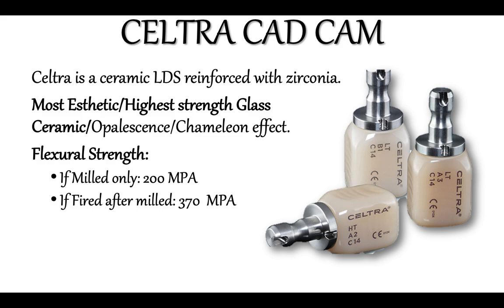We have some blocks. The name is Celtra. They're brand new. I would say they're the newest on the market, and we have some residents in Operative that are doing research about this. They apparently are more aesthetic because they have more glass than Emax and Empress, which you have probably already heard about.